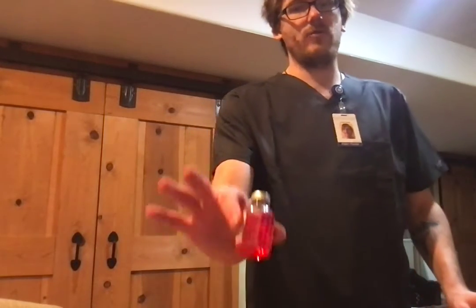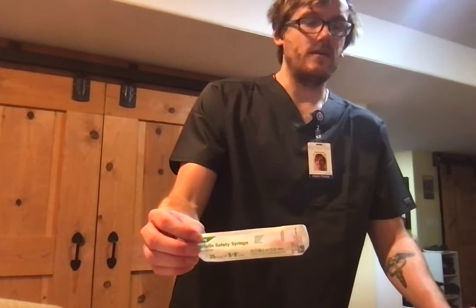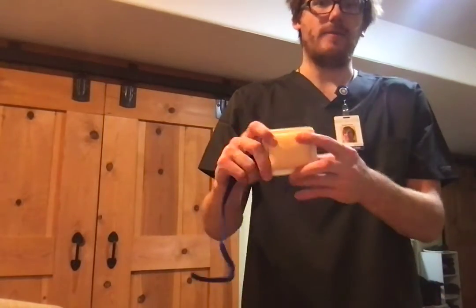This is my intradermal medication administration video. For this, I need a few things: a multi-dose vial, which in this case is going to be pretending to be TB or tuberculin, a gauze, some alcohol, a 1 milliliter syringe with a 25 gauge needle that is 5/8 inches in length, gloves, hand sanitizer, and my pretend patient.